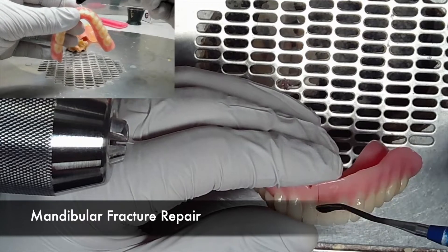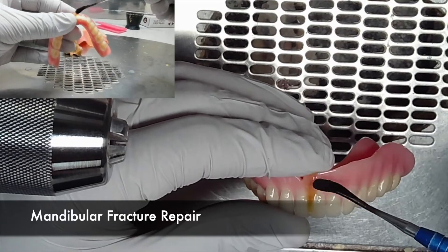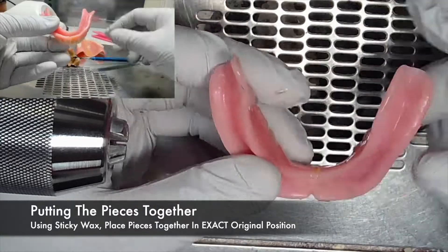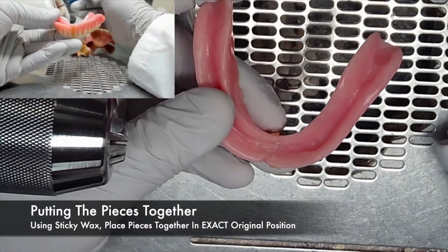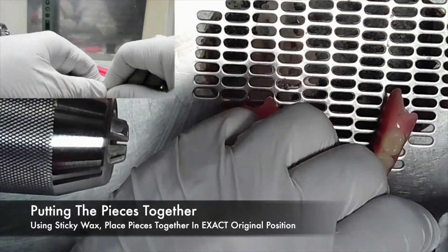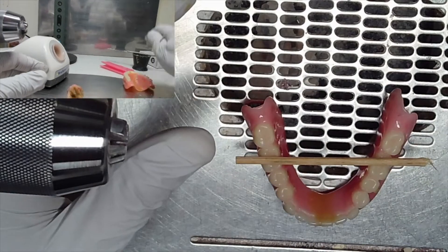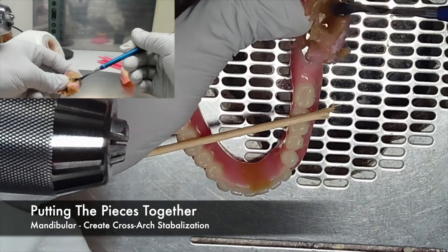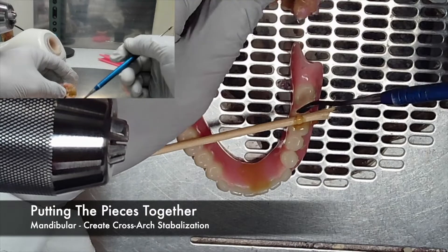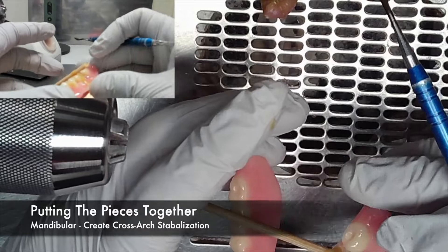Similar steps are taken with the mandibular base fracture repair. The pieces can be easily placed back together with the use of sticky wax. Be sure that these pieces meet exactly the way they did in their original positions in association to one another. Due to the shape of a mandibular denture, even when putting the pieces together with sticky wax, it can be extremely fragile. This is why the Air Force suggests using wooden sticks to create cross-arch stabilization, which aids when you need to fabricate a model in order to perform the fracture repair.